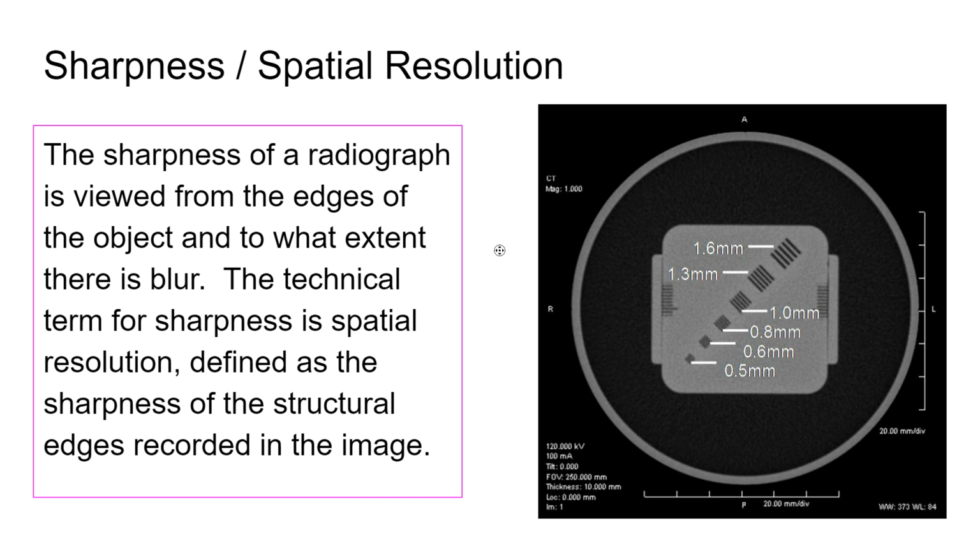It's kind of like this. If I have an object here and an object here, I can't tell them apart. They all fit in that one line pair. If I have more line pairs, making my spatial resolution better, theoretically, it becomes something like that. And now I can potentially separate them apart from each other.